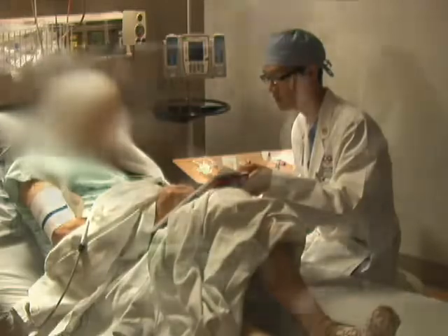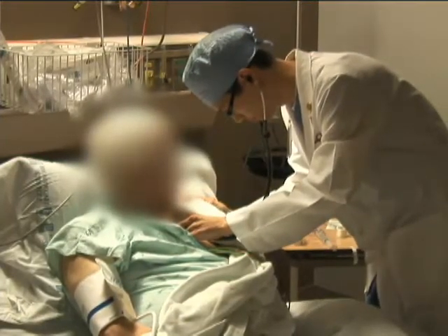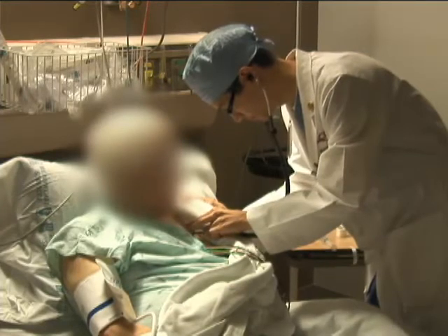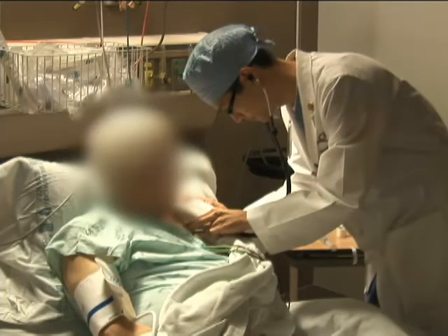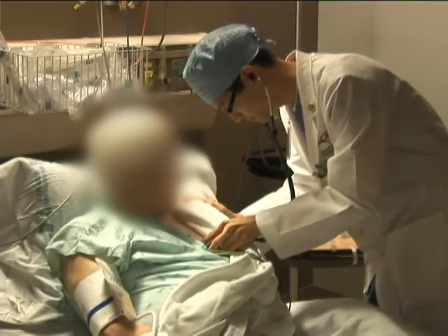is obtained. A focused physical exam including auscultation of the heart and lungs, visual assessment of the oropharynx, and palpation of the pulses is performed to assess the patient's risk for receiving conscious sedation.